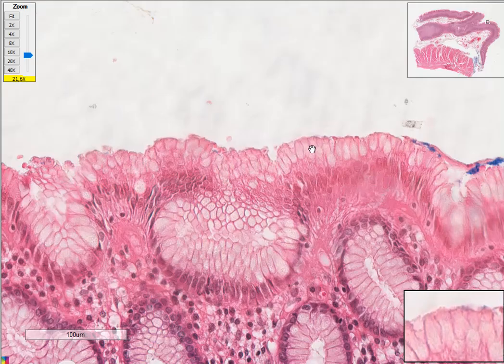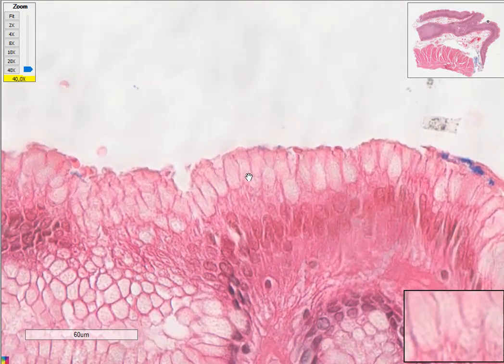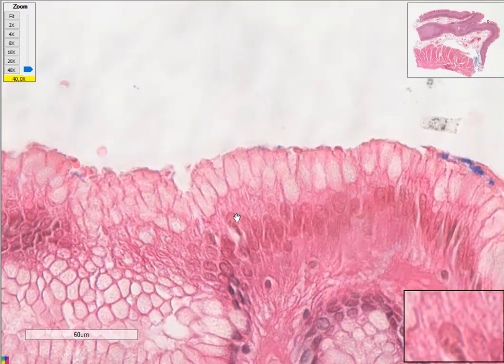And if you look carefully, let me go in a little bit higher at high power, you notice that there are some lines here. I can see 3 lines, but most textbooks show 4 lines.